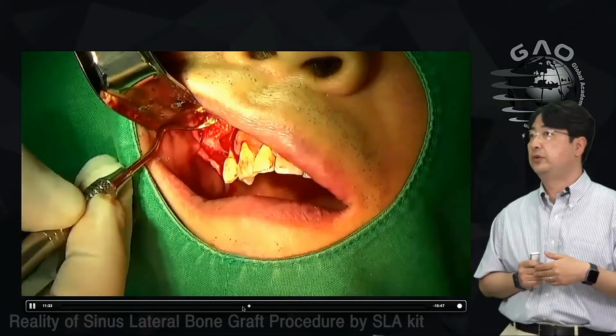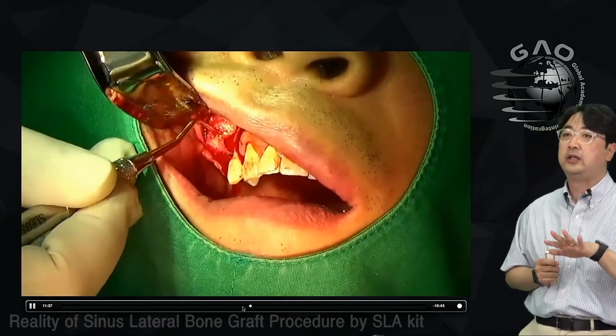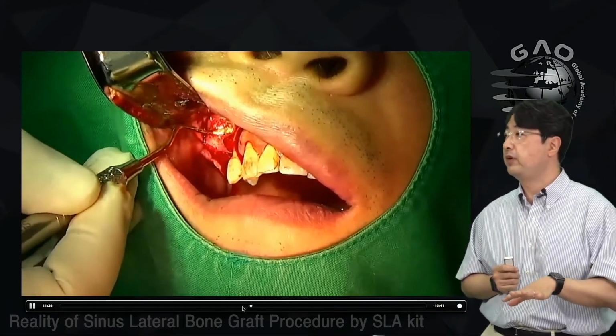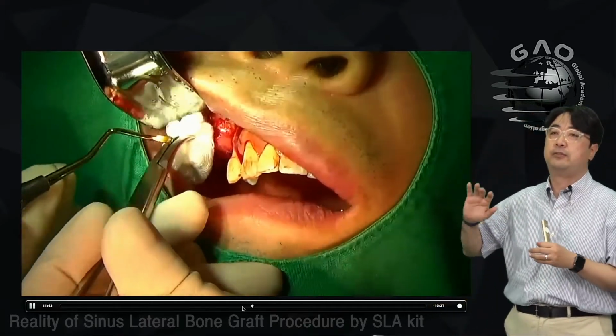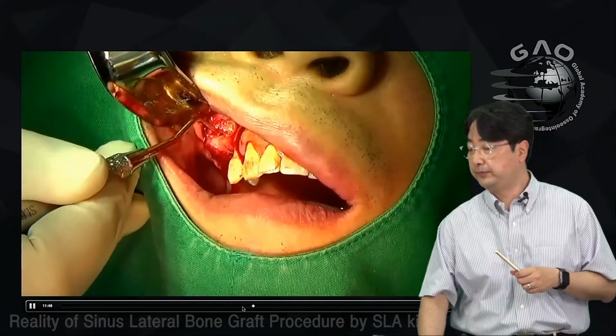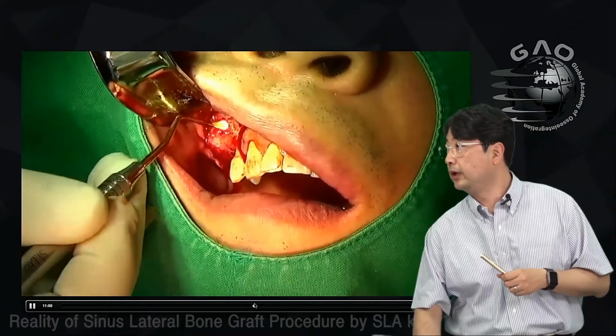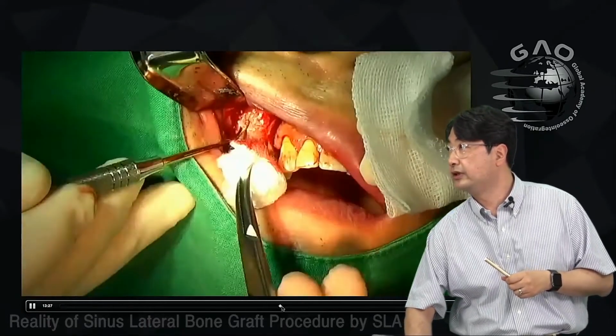So I do it very carefully. I'm using the Freer elevator to place the bone graft, and as I told you before, I do distal first, then I go medial, then I put in the middle part. Okay, so this is what I do. Repeating the bone graft procedure like this.